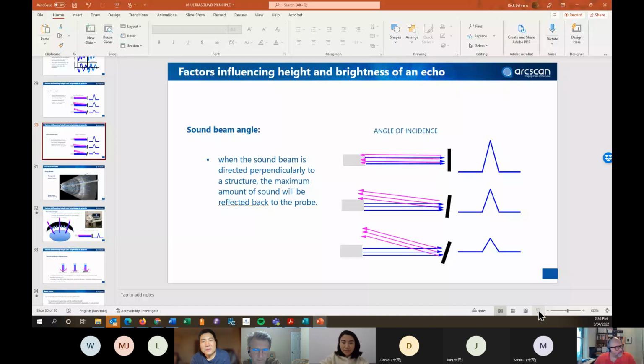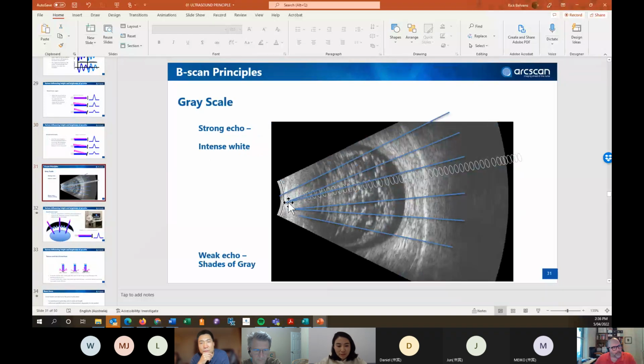Okay. On the linear scan, which is the second best option, the scan moves in a linear way, but this is not the typical UBM scan. A typical UBM scan will work like that. It's lines that are all going from one place. So they're going to go one line, then it's going to move in this direction all the time.